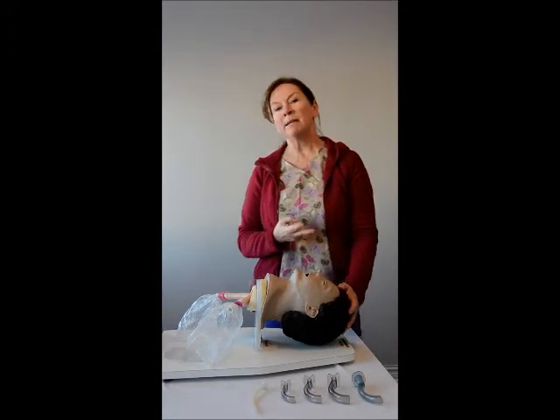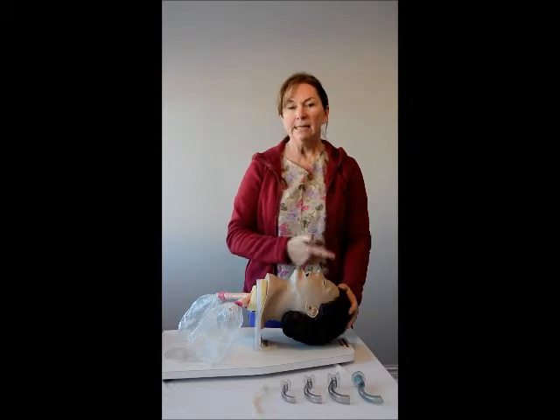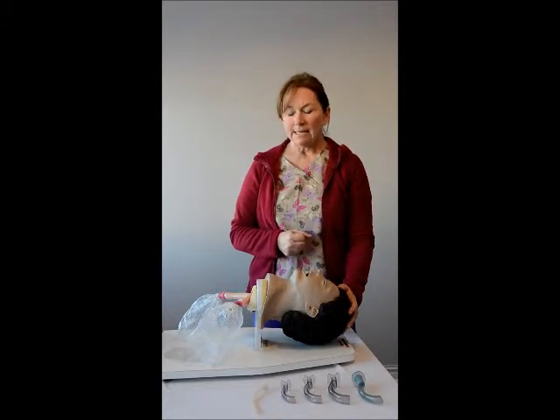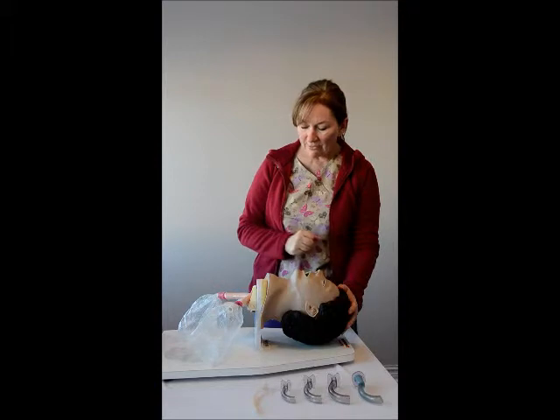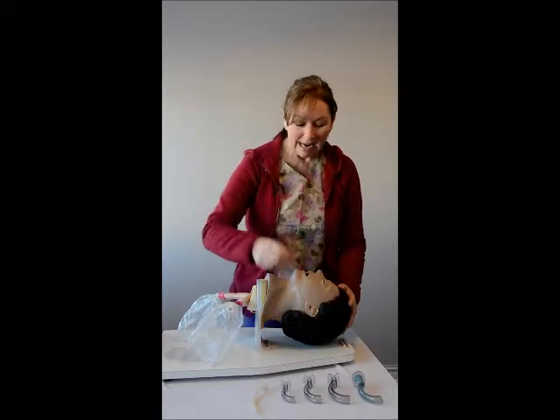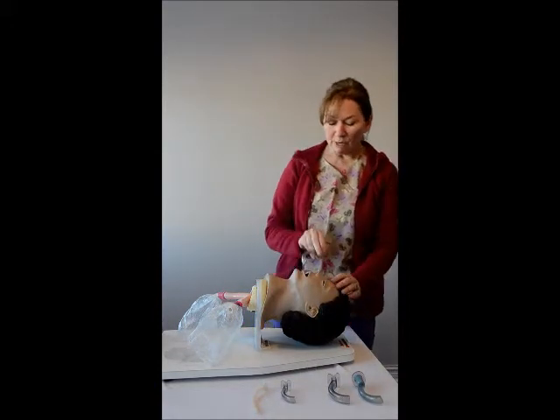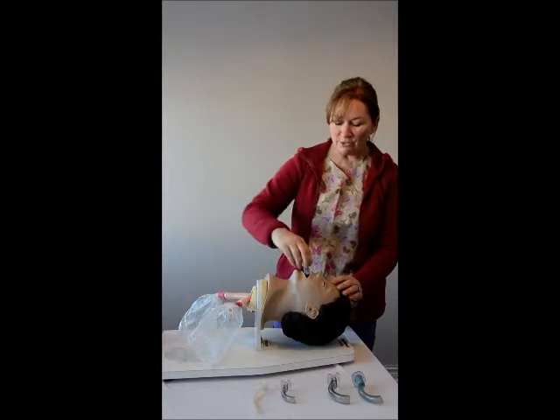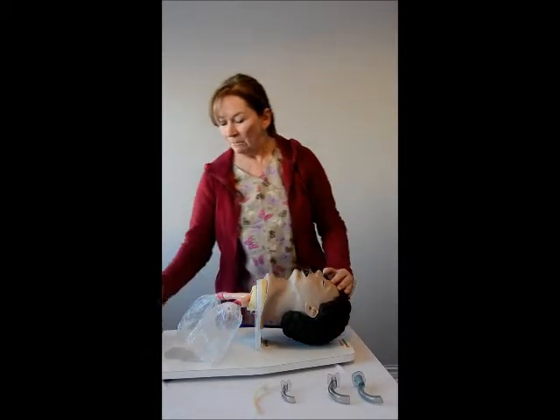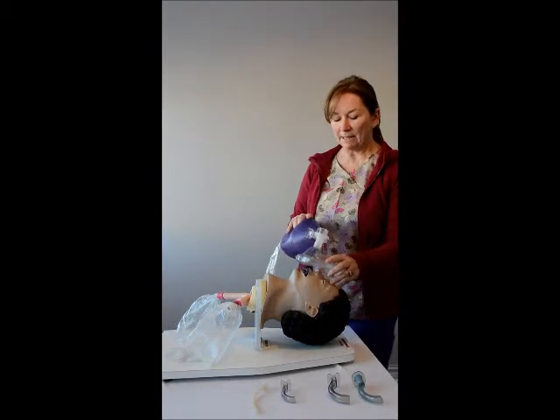The third part of CAB is breathing. I'm going to confirm there is no breathing, take the oral airway I've determined to be the proper size, insert it, then take my Ambu bag and start bagging the patient.